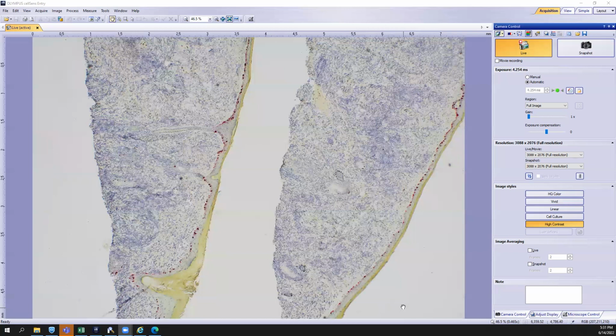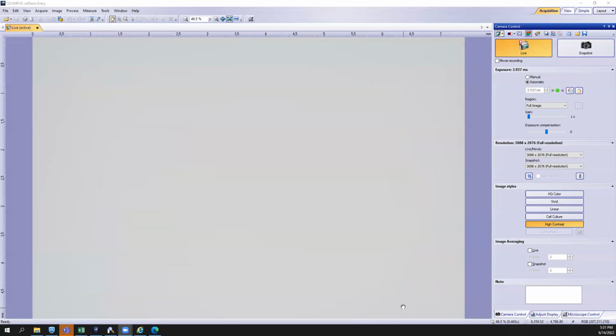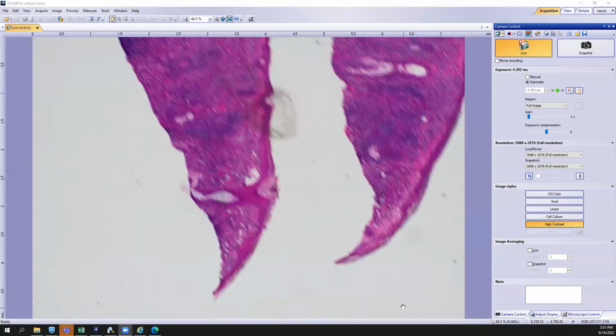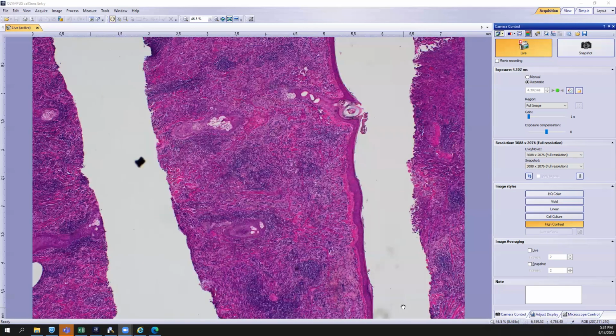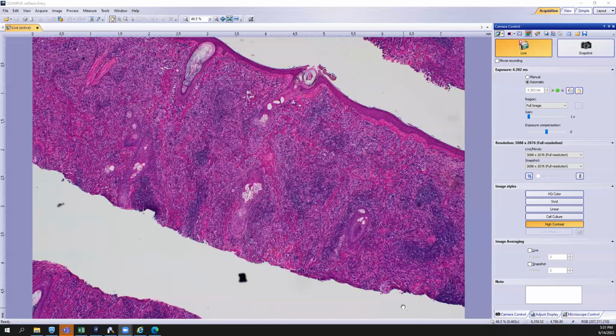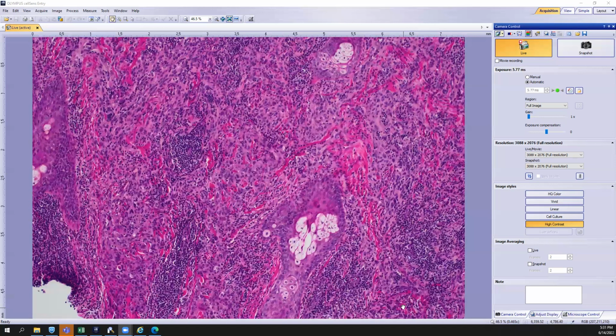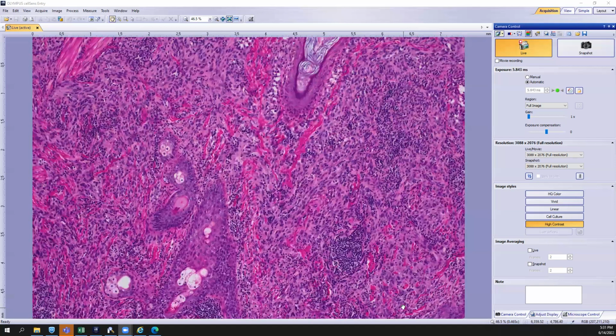All right, so this was a good example, and I'll show you the H&E again to end on, of an epithelioid angiosarcoma. So once you see one of these, you will not forget to think about it when you see an epithelioid atypical or neoplastic malignant proliferation on the scalp.